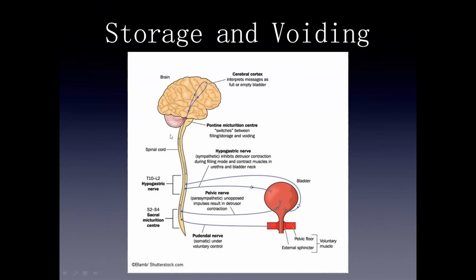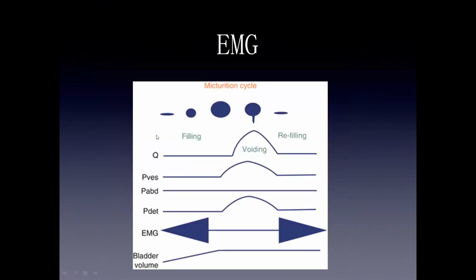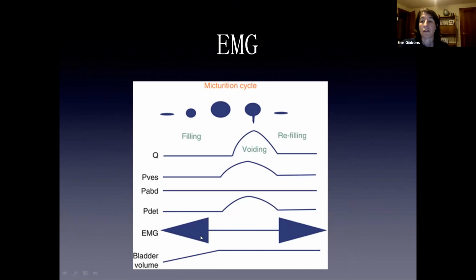Can you go back to the last slide? Can you repeat the explanation? I didn't really catch it. Sure, of course. So the EMG is what our sphincter is doing. Our external urinary sphincter, what is it doing throughout the test? If we think about sitting here right now, all of us, our sphincter is closed and it is actively closed while our bladder is filling.